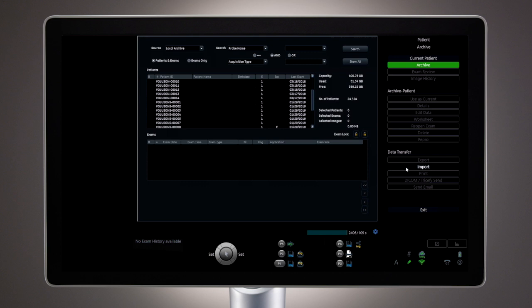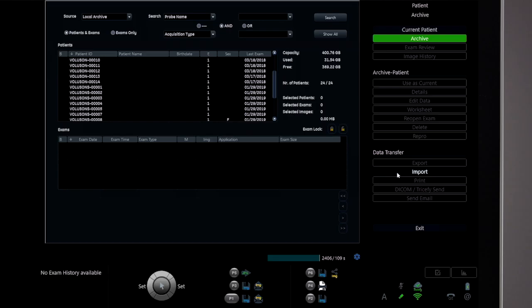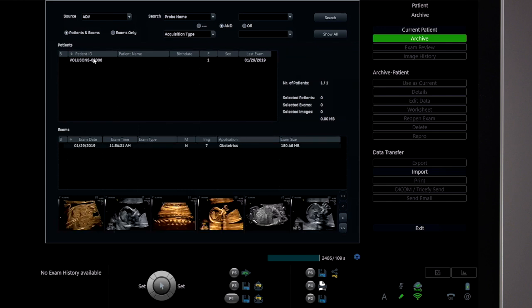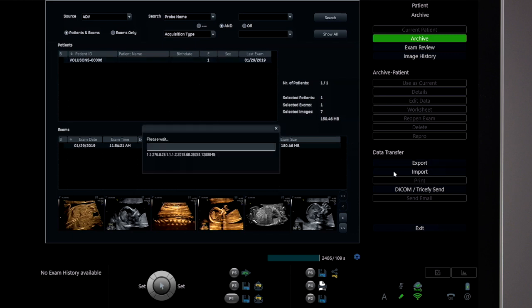Import of Voluson format files works the same way. Select Import from the display menu or touch panel, and a prompt will appear to identify the location of the exams to be imported. Once the exams appear, select them, then choose Import again from the menu.